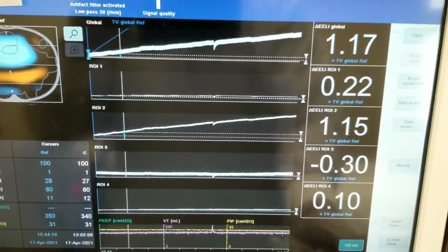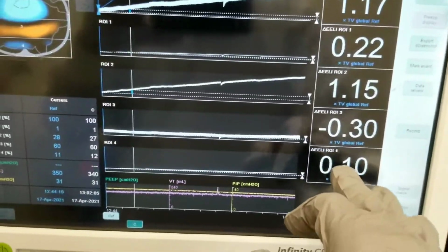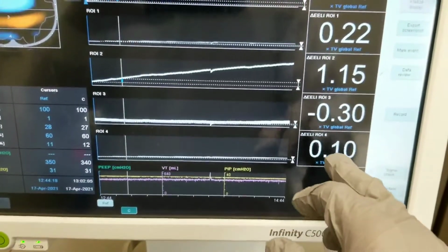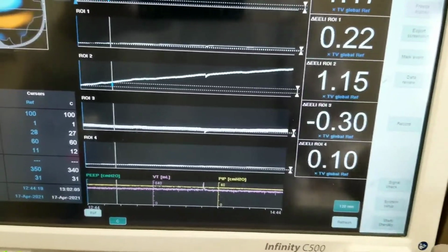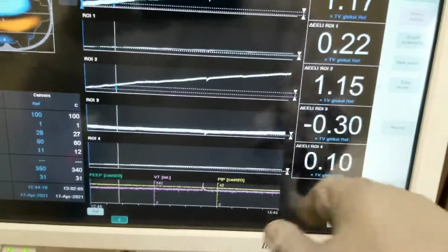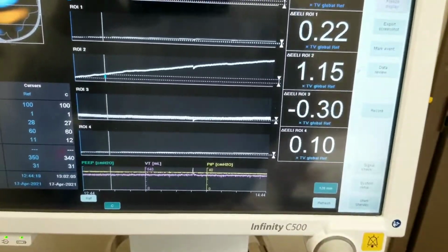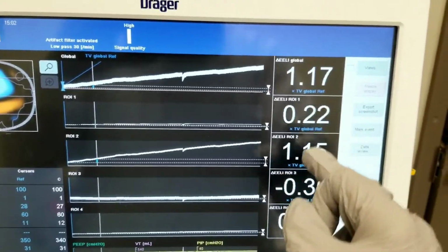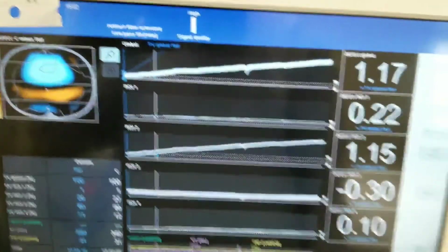Now, we have to keep in mind that when we started all of this, the dorsal region, which is 8 to 15% of the volume should be distributed there, it was already 8, and then it increased actually to 11%. So I'm not expecting much more drastic increases in impedance here, but I am expecting actually some increases more over here, because that's where there was really no substantial amount of volume happening.